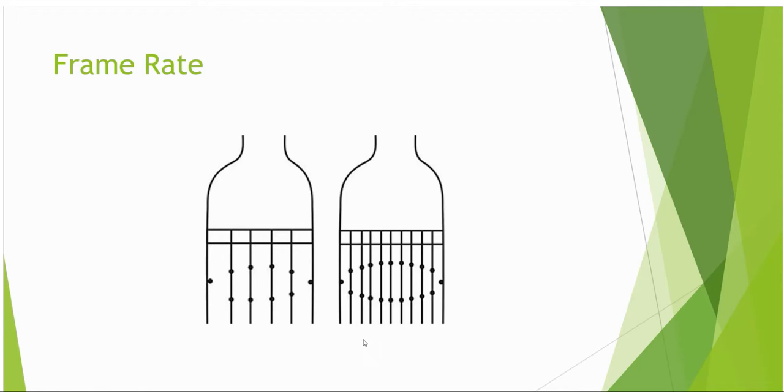Line density can be adjusted. Increasing the line density, as it suggests, increases the number of lines of sight in a specific field of view. More lines of sight mean more time required for the transmit and receival of sound waves, which in turn will lead to a lower frame rate. By decreasing the frame rate this way, we have adjusted the system for improved spatial resolution.